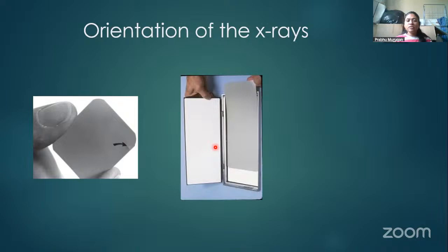So if you place it that way, you're going to have a tire track appearance. That is the imprint of the shape in your lead foil, right? That will be present, overlapping your X-ray image. So it is going to compromise your image quality, leading to an artifact.